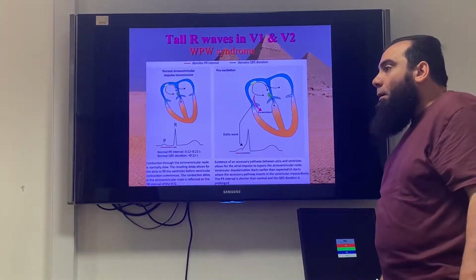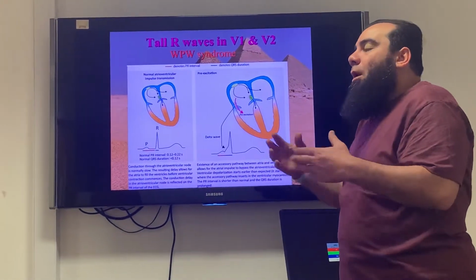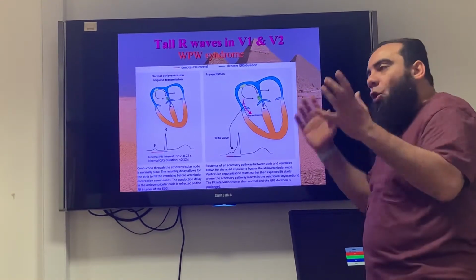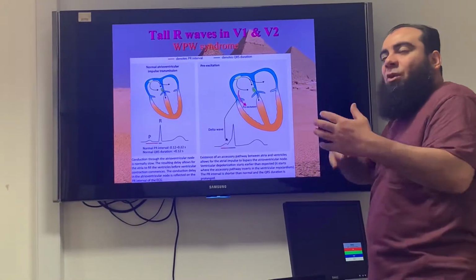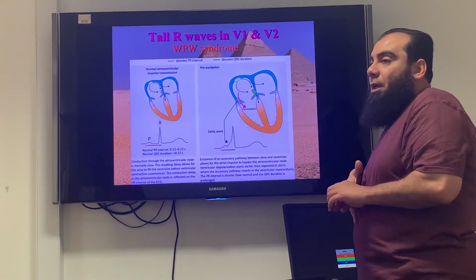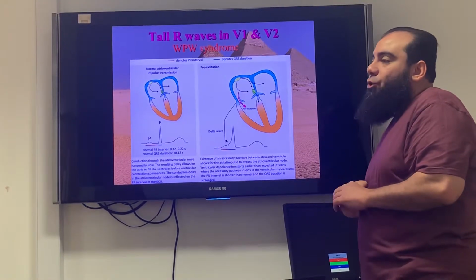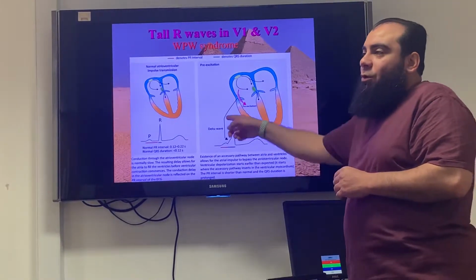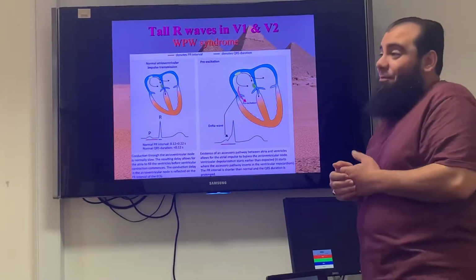What's the danger with it, Wolfpack? The danger of pre-excitation is that the patient can go into SVT, like tachyarrhythmia. We're going to discuss all of the tachyarrhythmias later at the end of the course, but it's good to mention that in between, so you can build up the knowledge. It raises a very big issue about tachyarrhythmia, and also about which medication we choose, because most of the medications we use for SVT block the AV node. In this situation, if we block the AV node, the patient could die, because the issue is not the AV node, the problem is the accessory pathway. So it's a bit tricky.